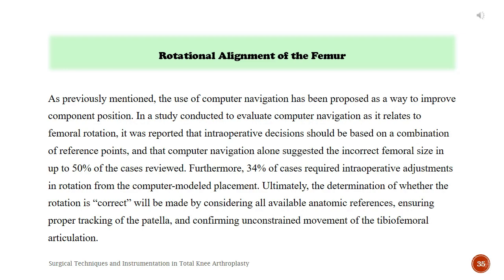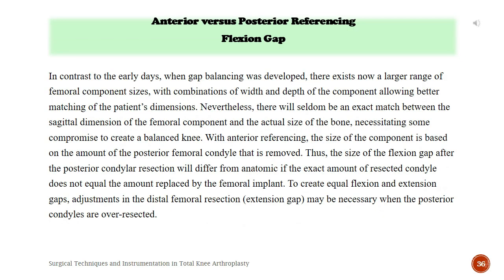Ultimately, the determination of whether the rotation is correct will be made by considering all available anatomic references, ensuring proper tracking of the patella, and confirming unconstrained movement of the tibiofemoral articulation. Anterior versus posterior referencing, flexion gap.